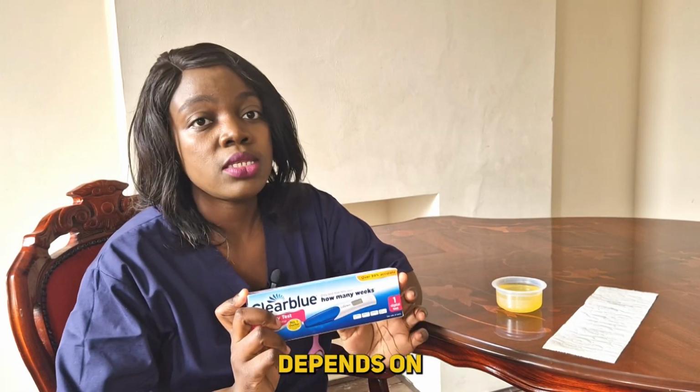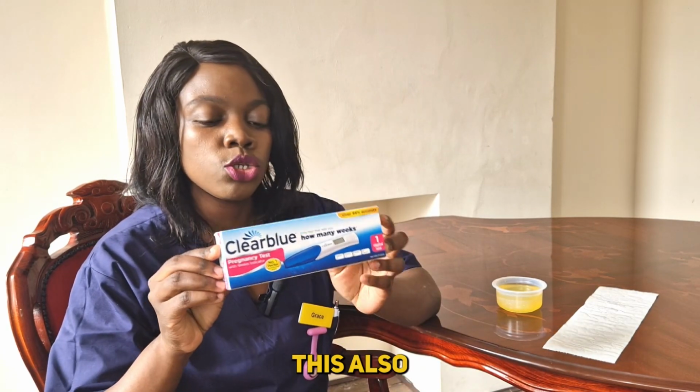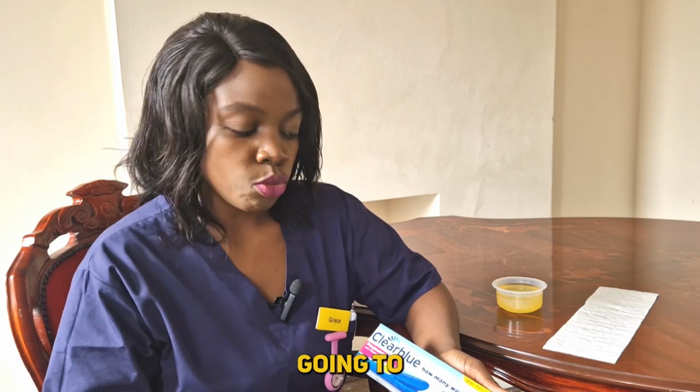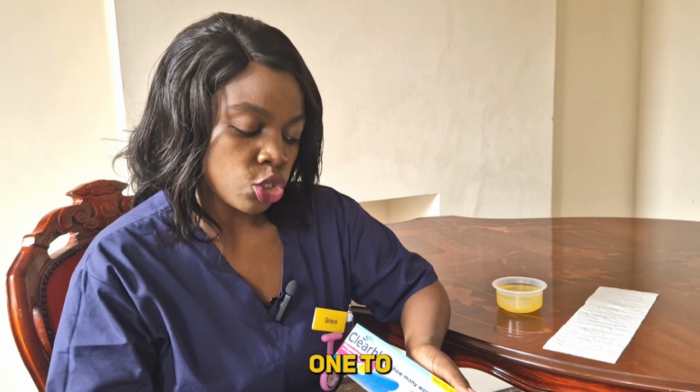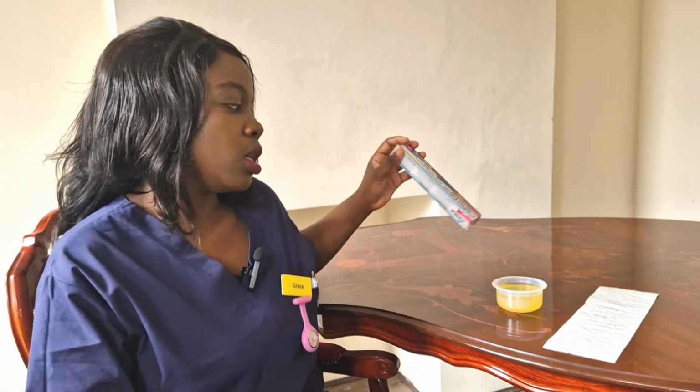So it depends on what you're looking for. And also this, you can see it's also a pregnancy test with weeks indicator. This also shows the amount of weeks that you're going to be showing. So it can either be pregnant 1 to 2 weeks, pregnant 2 to 3 weeks. So it normally tests depending on the amount of HCG that is in your body. So you can use any strip that you found.